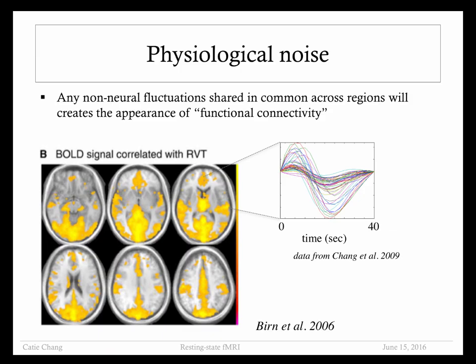Unfortunately, you can see that it affects many regions of the gray matter, overlapping with important resting state networks. So if you can imagine placing a seed in an area that contains a lot of breathing-related noise, then you would see inflated correlations with all the other areas that show strong breathing effects if you don't try to remove this. And there's also the danger of systematic differences in breathing across subjects or across populations, and so something like this might show up as increased global connectivity in one population versus another. So we always want to try to reduce any known sources of noise as best we can.